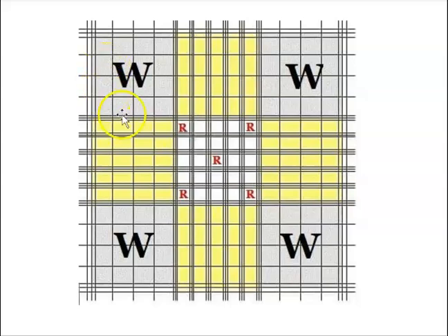And each of these large squares are usually used for white blood cell counting. And that's what this W is here for, representing white blood cells. These smaller squares are usually used for red blood cells. So this small little square right here is for red blood cell counting.